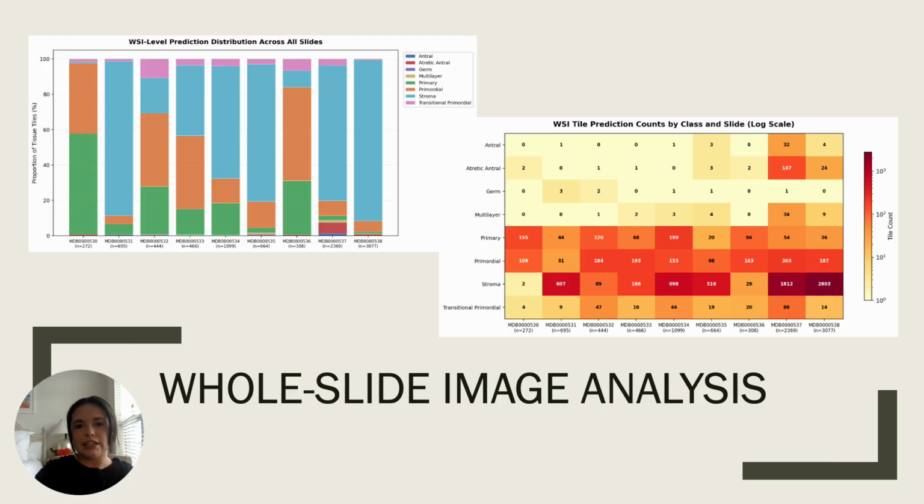Once trained, validated, and tested, we used all 9 naked mole rat slides from the mother dataset to evaluate the application of the CNN to whole image ovarian histology slides. To be evaluated by the CNN, each slide was tiled into non-overlapping 224 by 224 pixel patches, and a mean intensity threshold of 220 pixels was applied to exclude background tiles.